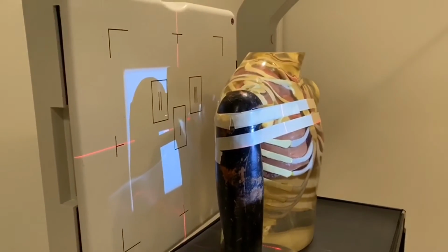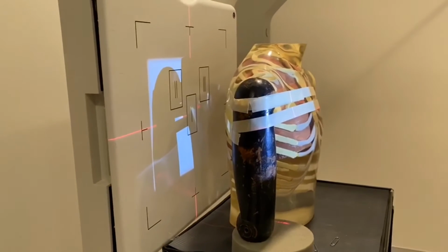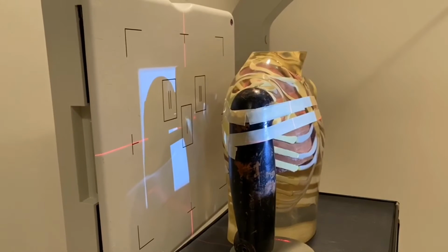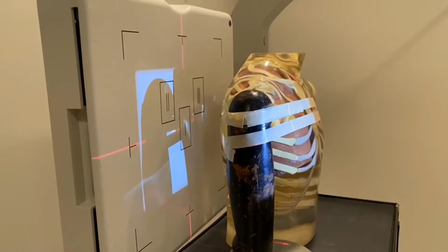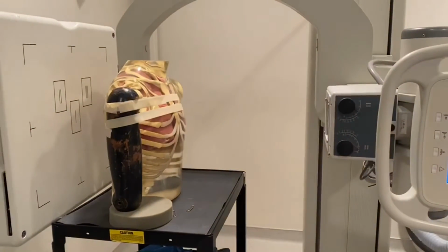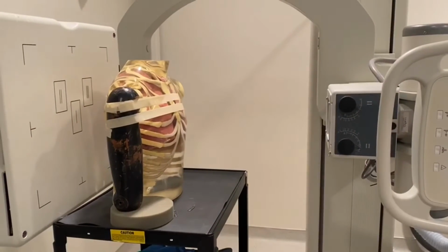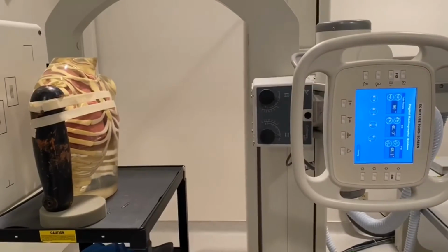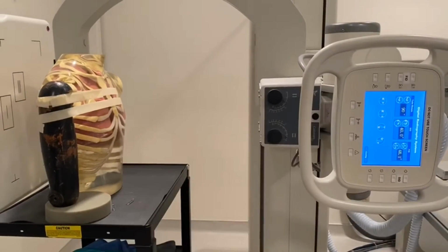And then just make sure you guys have a 10 by 12 field of view. The 12 is going to be crosswise, and the 10 is going to be the lengthwise. Other than that, we'll set that up. Make sure you have a marker on there, and then you'll be able to go ahead and do your technical factors and then evaluate your images.